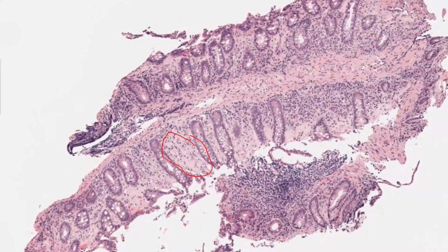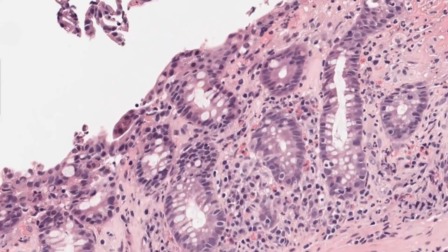So let's think. But I told you a minute ago, if you were still awake with me, that in ischemia you don't have an increase in inflammatory cells. In chronic ischemia in general, you don't have an increase in inflammatory cells. Like in here, you can see that there is definitely an increase in inflammatory cells, which is present throughout. Now, let's focus a little bit on this area here and see what is happening. So there is an increase in inflammatory cells.